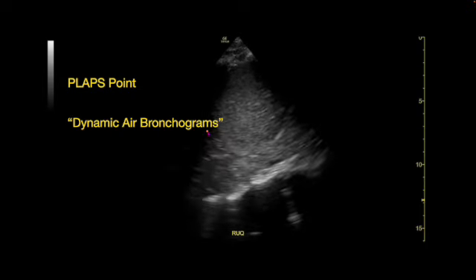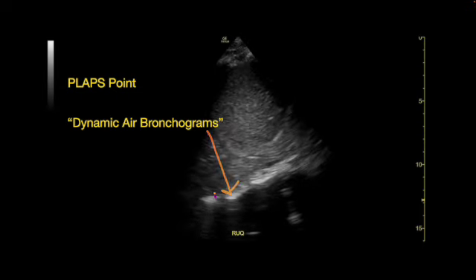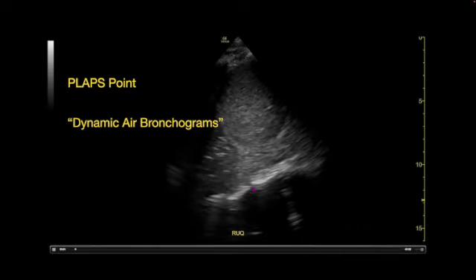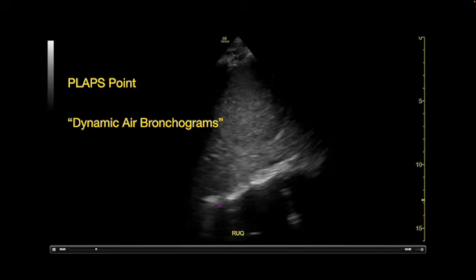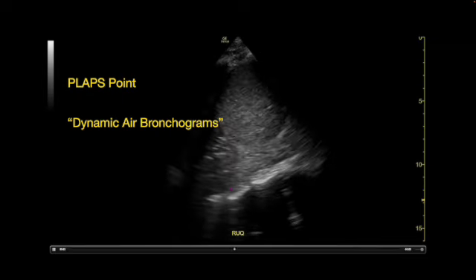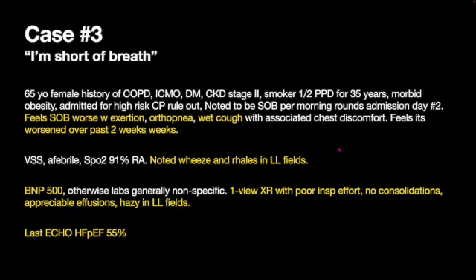When the ultrasound beams have a medium to move through, they bounce off the spine and they head back to the machine, and you get this. You can actually visualize the spine. It's called the spine sign. So you know that there's something in that thorax that is not well-aerated lung. It's either fluid, it's either atelectasis, it's something. All right. So in this individual, it is a pneumonia.